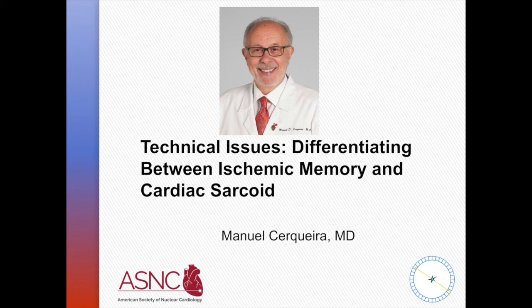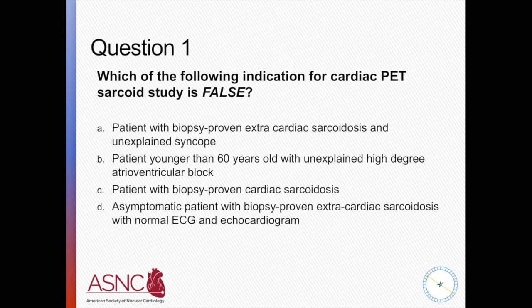So I'll read the question and then you can go through the answers. Question number 1: which of the following indications for cardiac PET for a sarcoid study is false? Okay, so we're going to go over one by one and just try to see which is the right answer here.